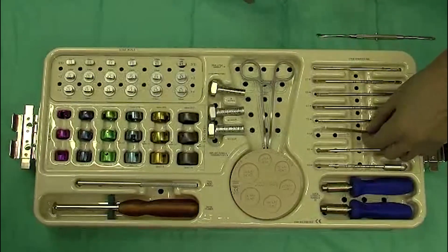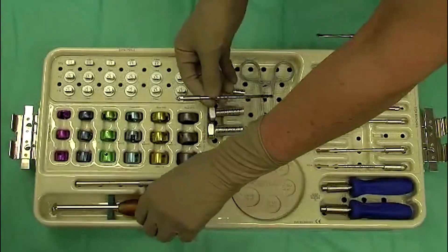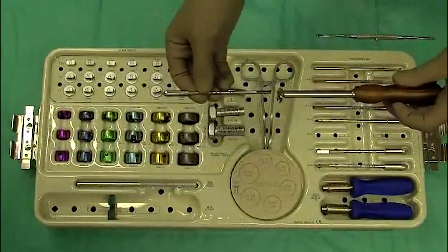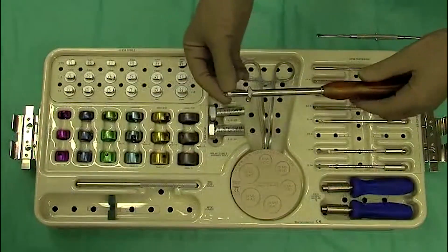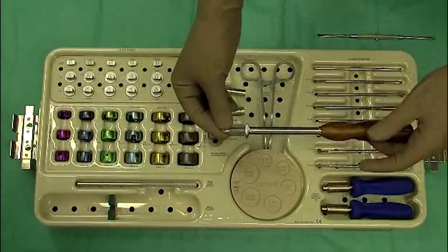We also have a so-called calcar reamer. Once the rasp is in place, the neck planer slips over the rasp and can rasp the radial neck.